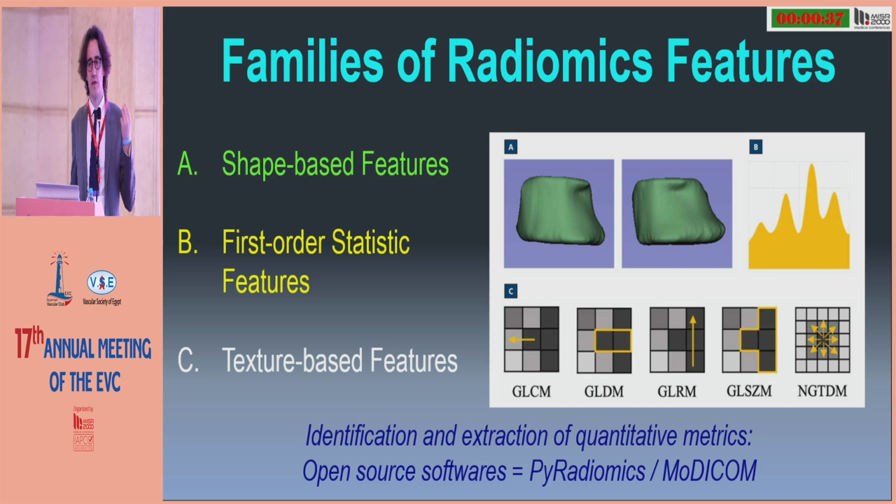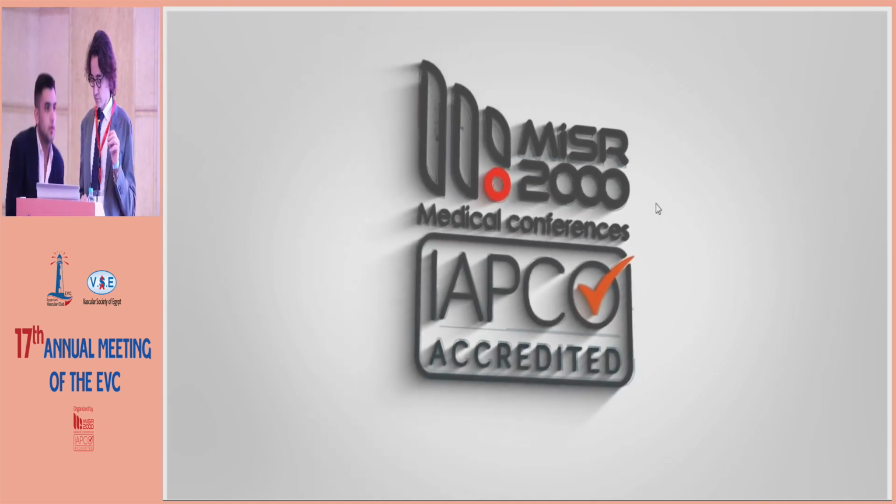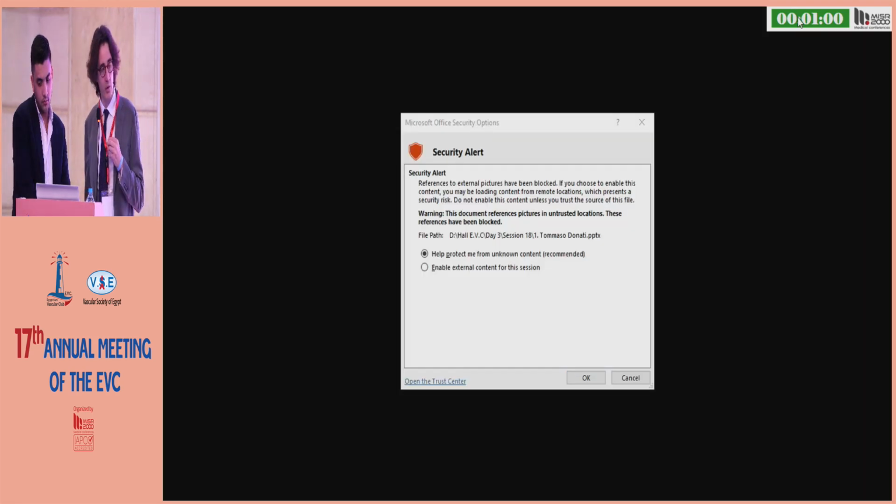Now, we all know, for example, when you look at dissections, true lumen, false lumen, we can see clearly the discrepancies between the two lumens, and we know that there is a flow effect and so forth. We can look at lumbar arteries for a type 2 endoleak, and we will see the contrast flowing maybe on a late phase, arterial or venous phase, and we will recognize that there is an endoleak. But through radiomics, what we're asking the machine is not to recognize an endoleak or to tell us whether there is contrast or not. We are going to look into patterns of grayscale that are invisible to the human eye. So this is going to change completely the way we are going to use and look at any sort of imaging that we are familiar with.